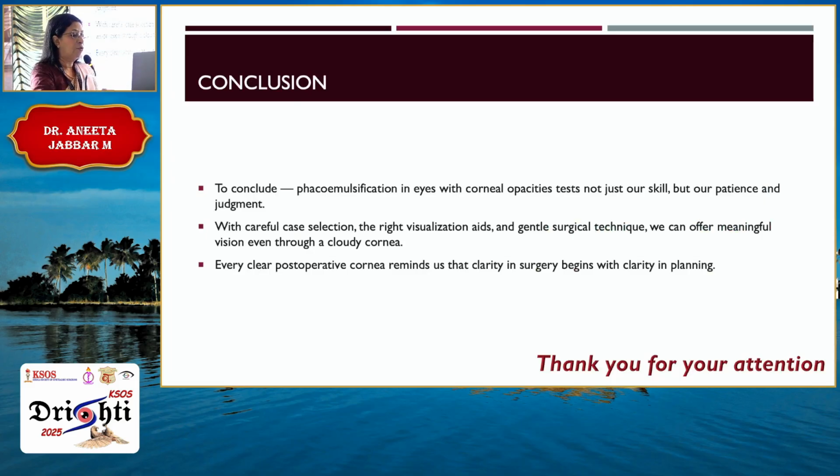To conclude, phacoemulsification in eyes with corneal opacities tests not only your skill but your patience and judgment. With careful case selection, the right visualization aids, and gentle surgical technique, we can offer meaningful vision even through a cloudy cornea. So every clear postoperative cornea reminds us that clarity in surgery begins with clarity in planning.